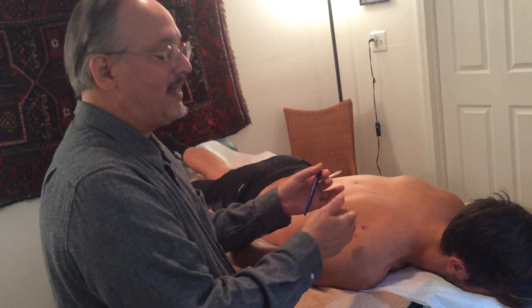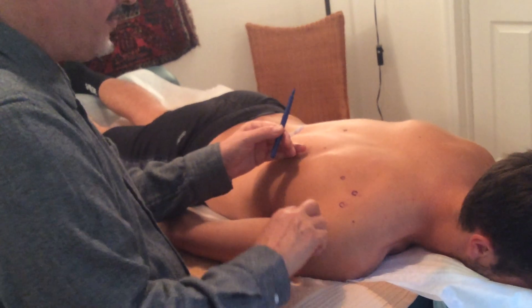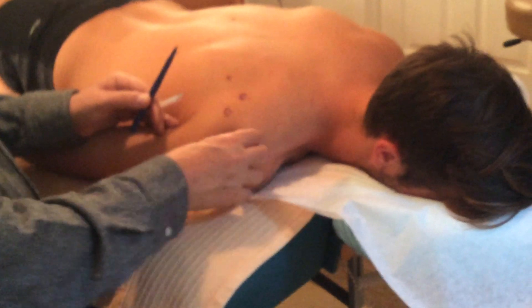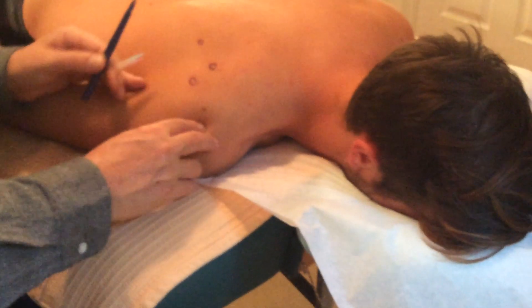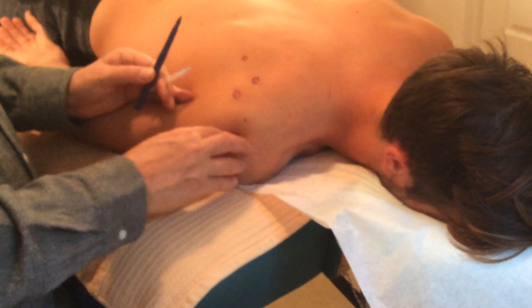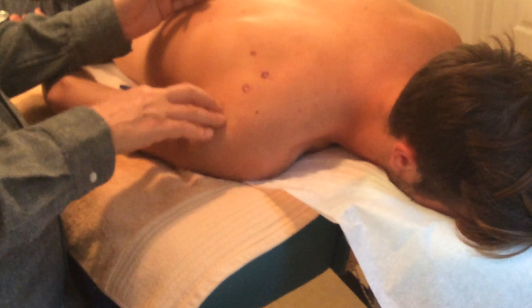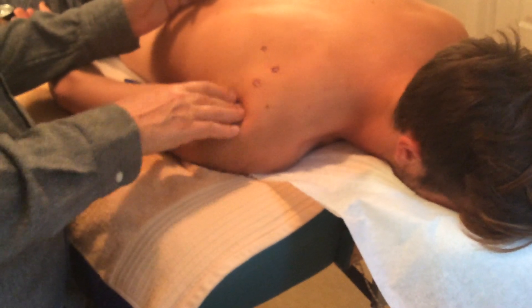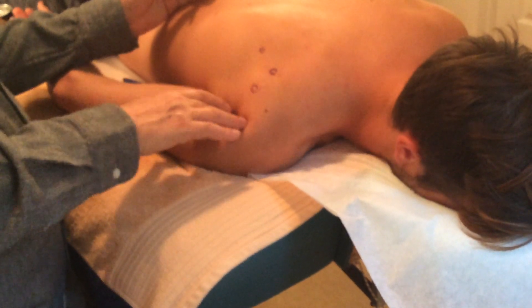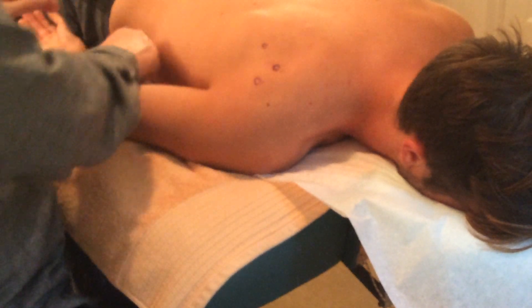Here's your shoulder joint, here's the spine of the scapula — the clavicle is in front. I'm going to come down here into this area. Is that tender? Not so much, not as much. Okay, good. All right, so that's enough — I'm going to needle these points.